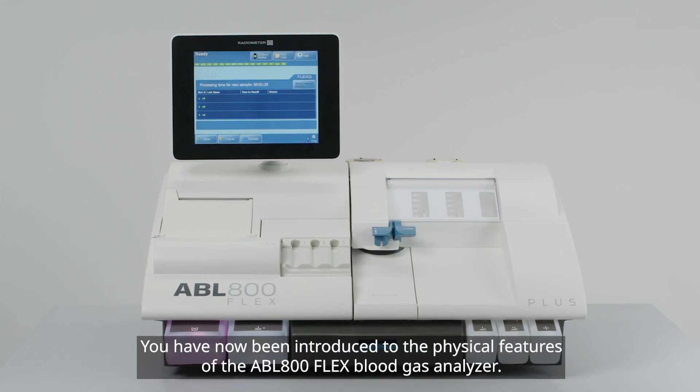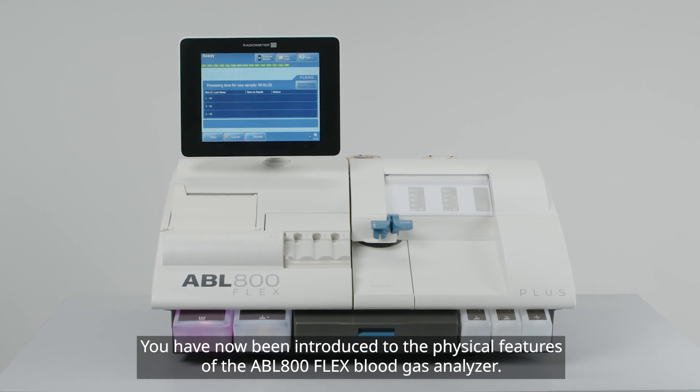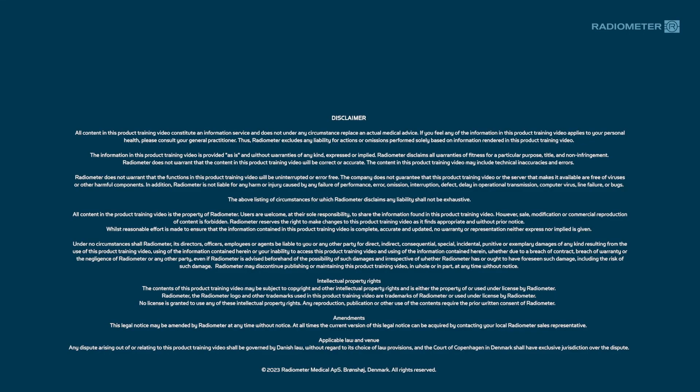You have now been introduced to the physical features of the ABL 800 FLEX Blood Gas Analyzer.